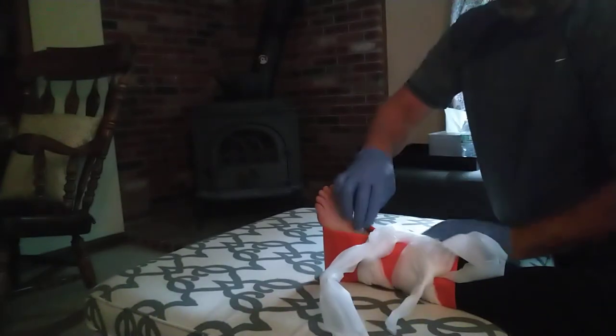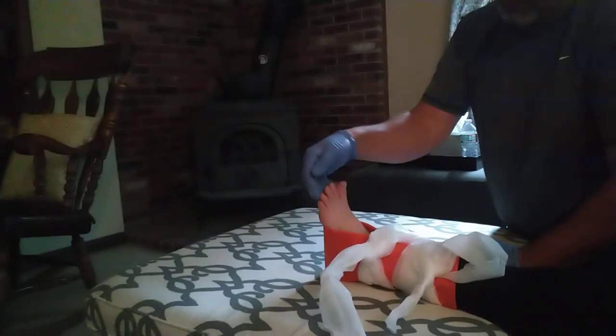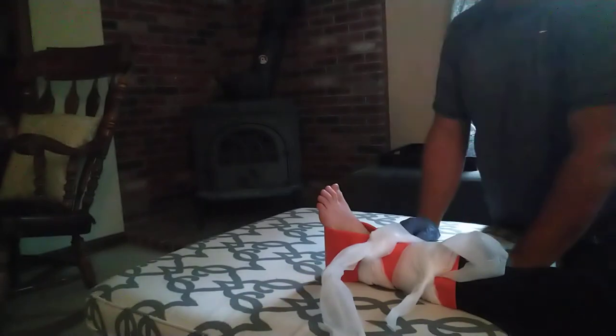And then check CSMs again. Check for a pulse — I have a pulse. Can you feel me touching your toes? Can you push down on your toes? Wiggle your toes. Perfect. She has CSMs still.